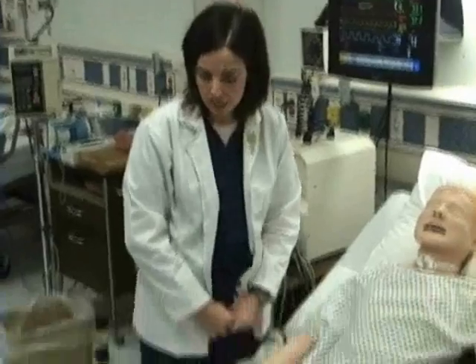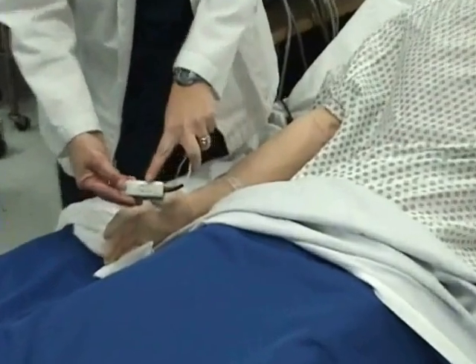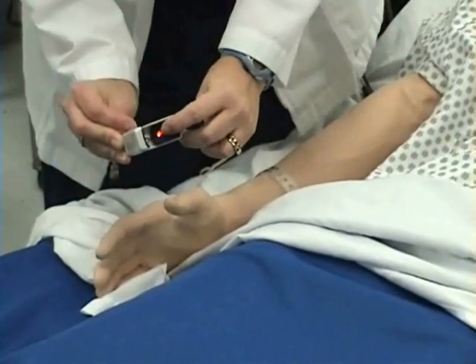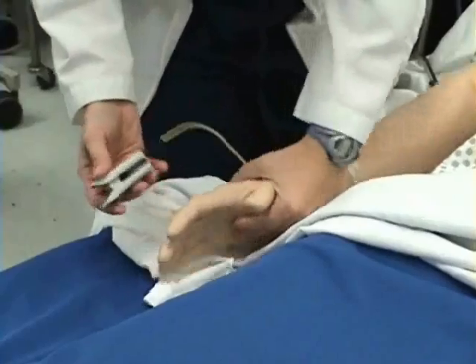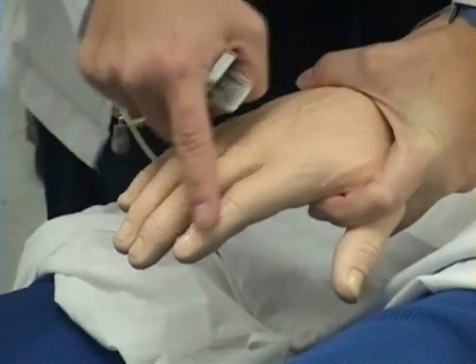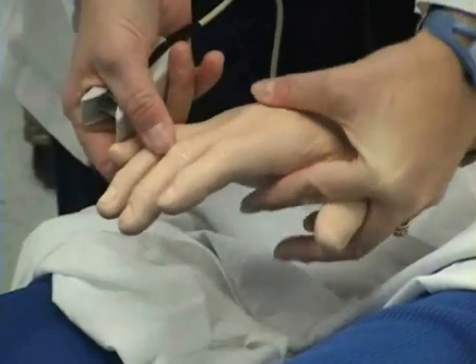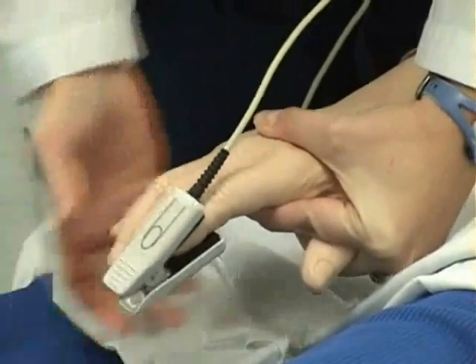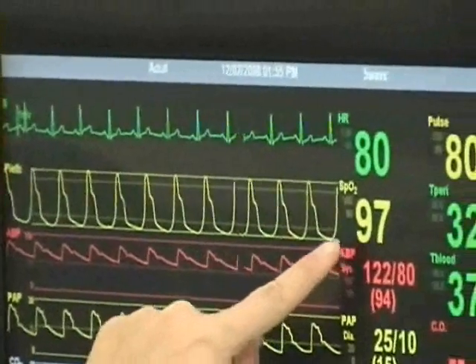Now I will take a pulse oximetry reading on my patient. This is my pulse oximetry probe. It has a finger on the top of it and the red light is also on this side — this is the side that goes where the fingernail is. I place the probe over my patient's finger. I want to make sure that there is no nail polish on the nail. My pulse oximetry reading is 97.